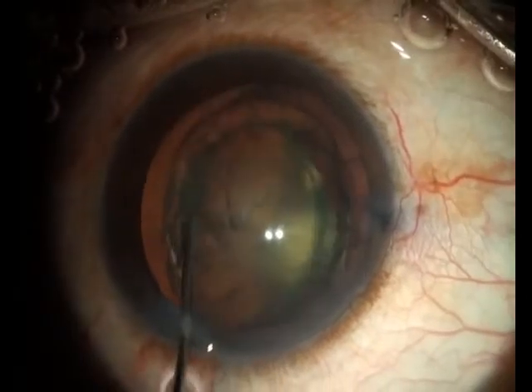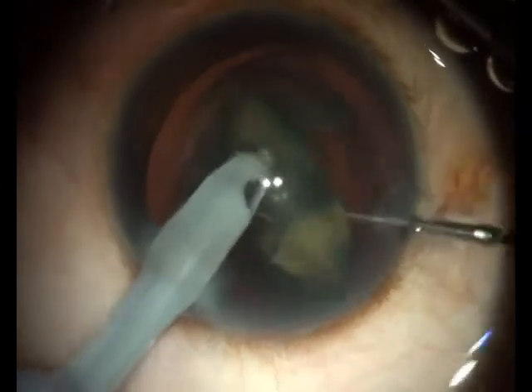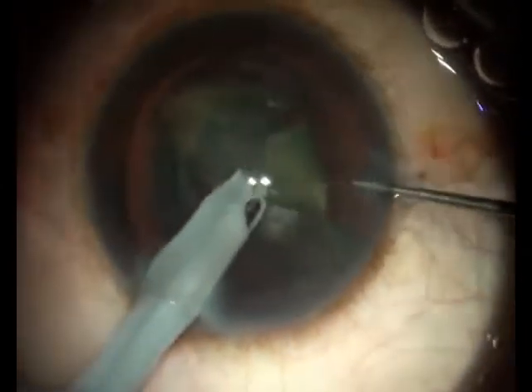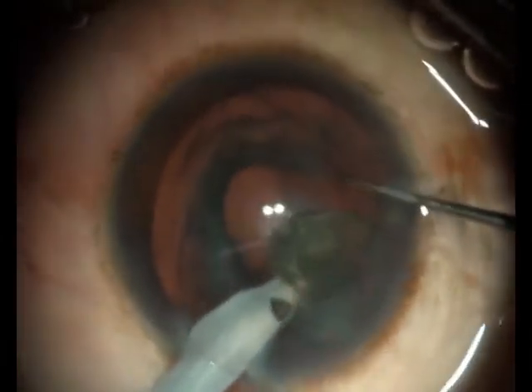In this case of a soft polar cataract, after hydro delineation, the nucleus is impaled with a phaco probe and whilst holding it, is just lifted out of the bag, after which it is suitably downsized and emulsified.